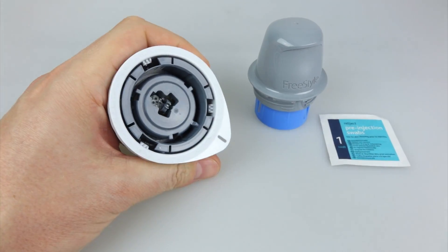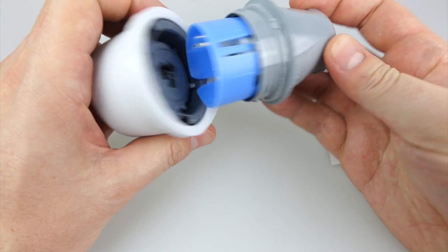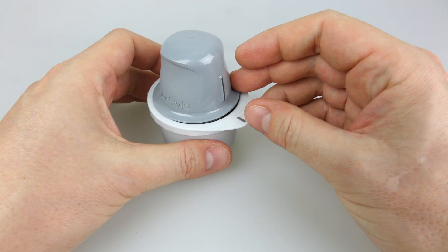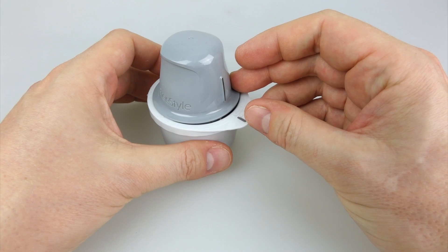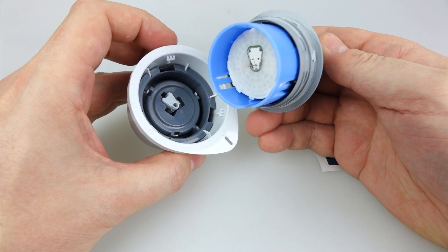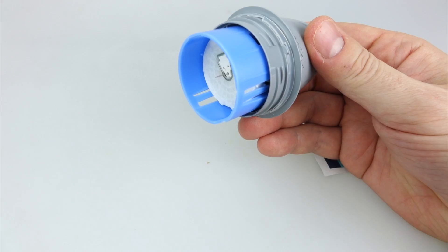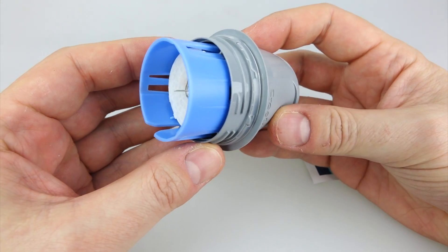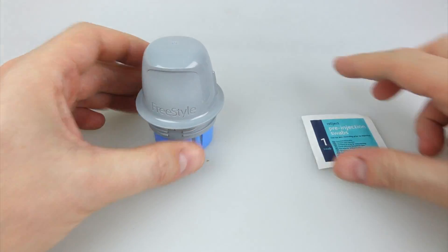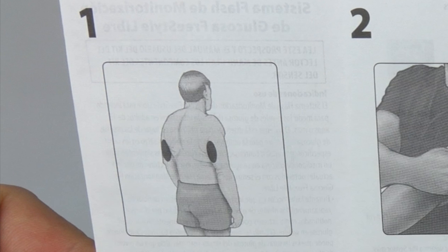We attach the applicator to the sensor, which is in this airtight box here — you line those two things up together and push them into one another, you'll hear a click, and that means it's primed and ready to go. You'll see the lines on the right there show how they line up. It's spring-loaded, and if you look on the right-hand side you can see in the middle there's a filament coming out — and yes, it does go subdermal. It's not just a patch on the outside of your skin; it has to go under your skin to read the blood glucose.